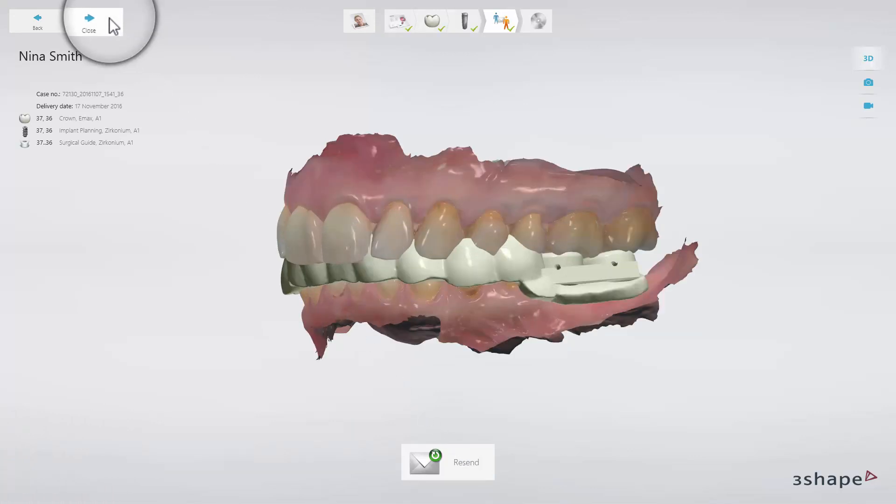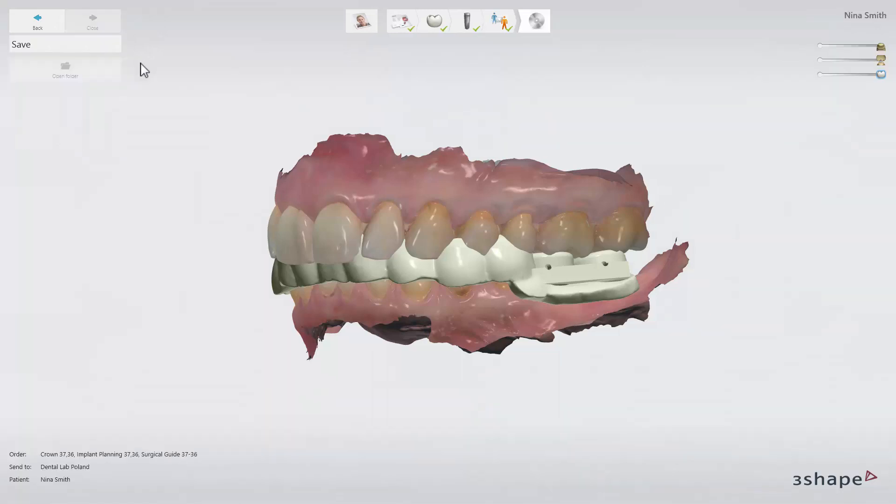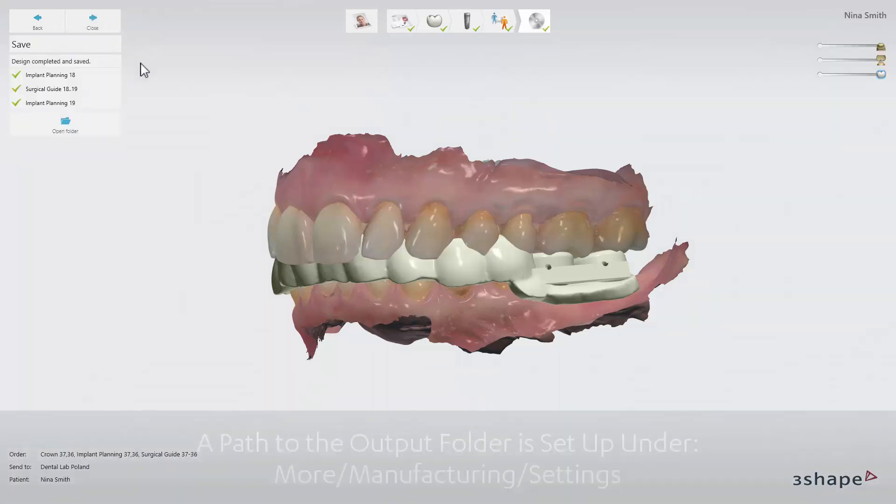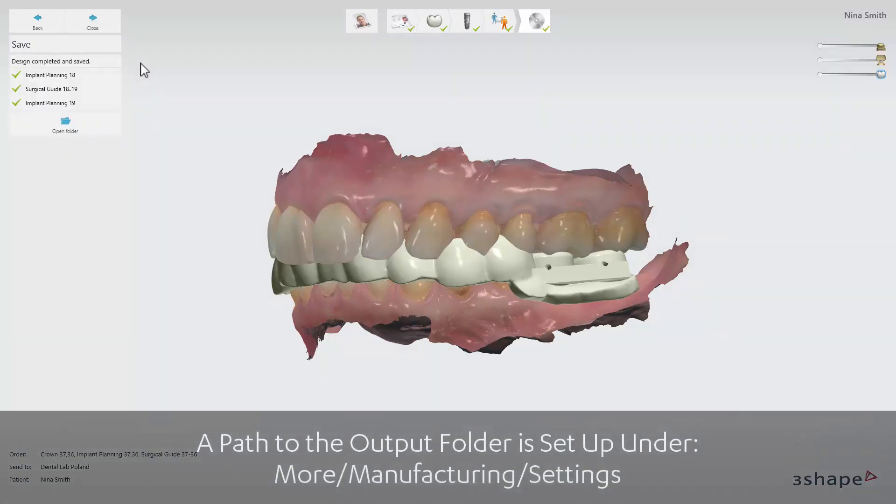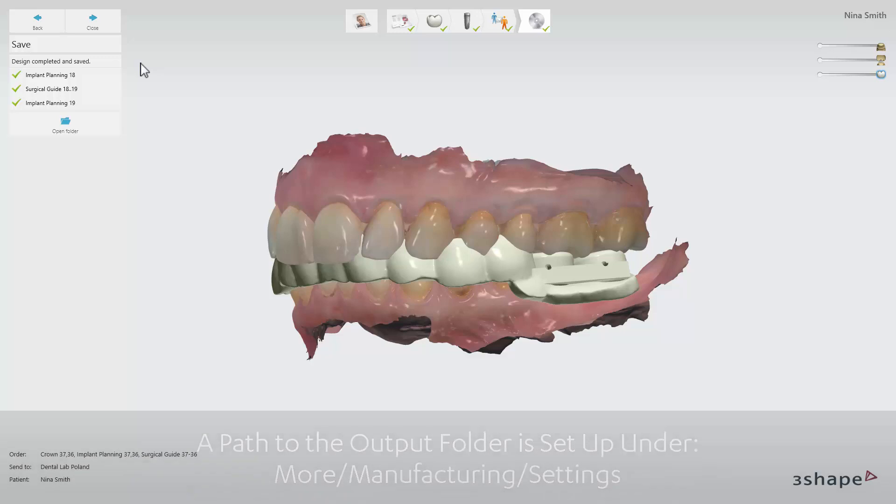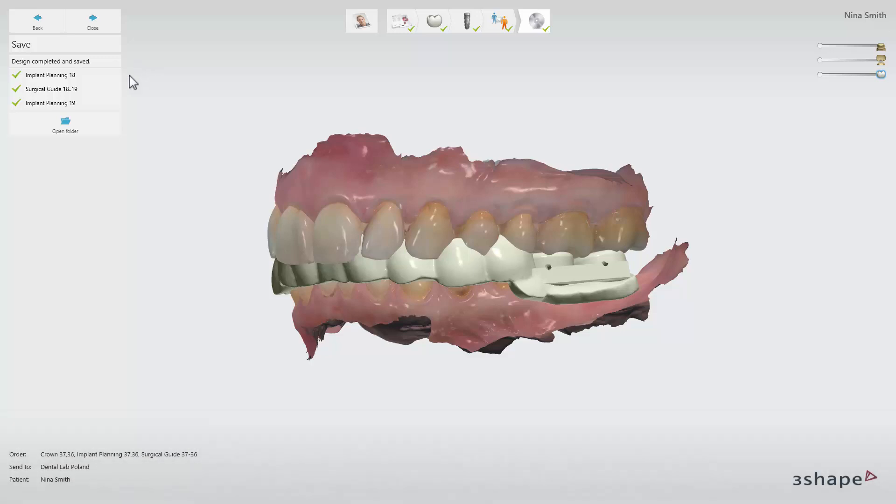Click Close to move to the Save step. When you move to the Save step, a surgical report and a drilling protocol are saved in your output folder and the CAM output is generated. To view the output folder, click on Open Folder.